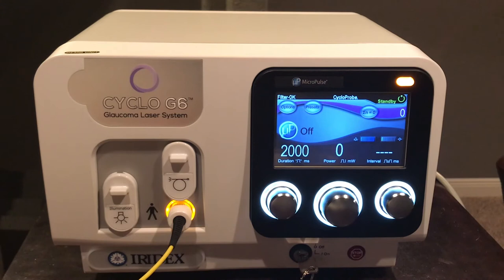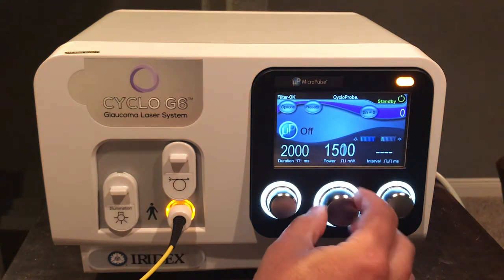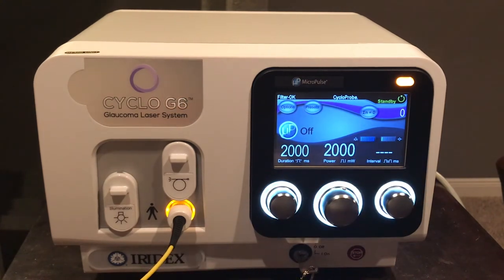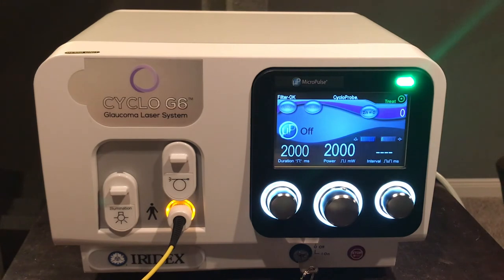For a standard continuous wave treatment with the G probe delivery device, we will set 2000 milliwatts for a duration of two seconds with no interval — delivering a continuous wave of 2000 milliwatts for two seconds. Once everything is set and the physician is ready, engage the orange illuminated button on the upper left. It will blink and then go solid. If the physician releases the foot pedal mid-treatment, the laser stops and resumes from where it was disengaged.